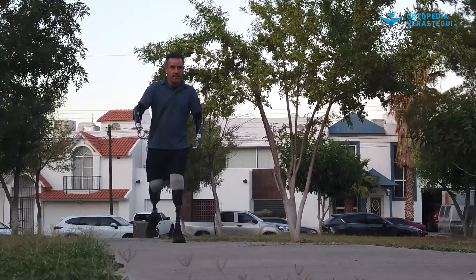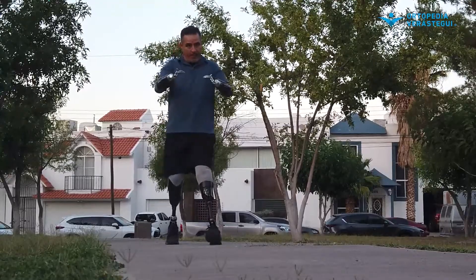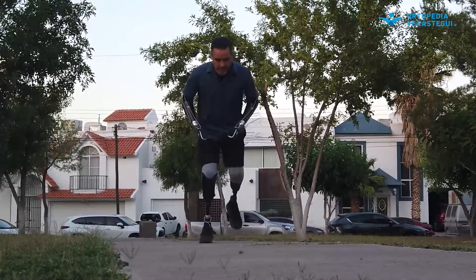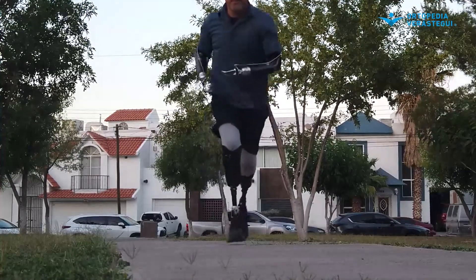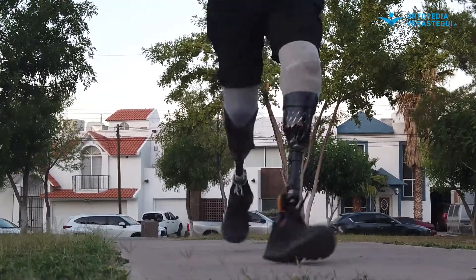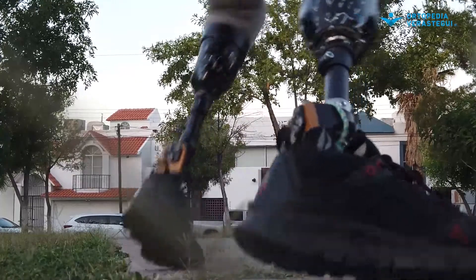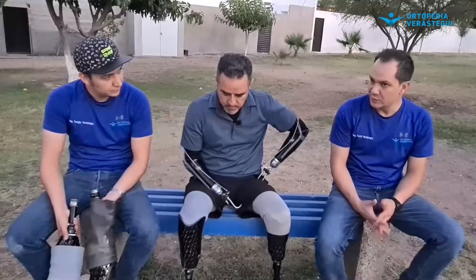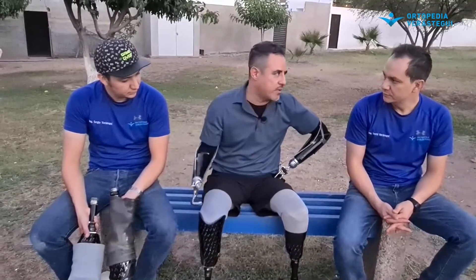¿Qué es el sistema One? Yo empecé con este vacío pasivo y funciona muy bien. Hay otro vacío electrónico que también probé, funciona muy bien, pero es más pesado y siento que hace mucha presión. Este lo siento muy ligero, muy cómodo, mucho más seguro. Como tiene las dos válvulas, el socket interno flexible y la rodillera por dentro, para mí las ventajas son muchísimas. A la hora de la acción te da más seguridad para ir escalando de actividad — haces lo que quieras hacer según tu condición física, sin pensar que se va a aflojar, mover, o pistonear la prótesis.